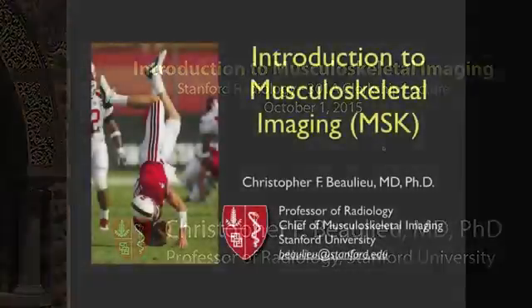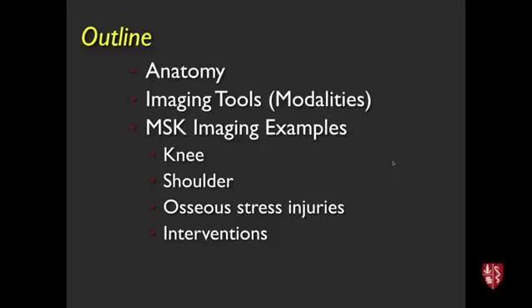Okay, well, so let's talk about musculoskeletal imaging. What I'd like to do is go over some very basic anatomy real quickly, and then I'll talk for the first portion about imaging tools or the modalities we use in MSK, and these overlap quite a bit with the other subspecialties. And feel free to interrupt me at any time and ask questions, even though I'm recording this. I won't try to be very formal.